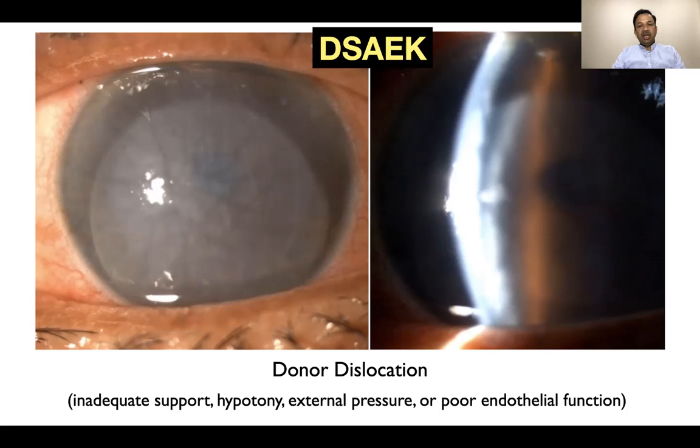Donor dislocation can happen if there is inadequate support, if your air bubble has disappeared too fast, or it has gone into the posterior segment, or if there is hypotony, or if there is any external pressure, the patient rubbing the eye, or because of excessive manipulation, or the donor graft has poor endothelial function. You can have the donor graft not sitting in position. It can be displaced inferiorly, or there can be separation between the graft and the host cornea.